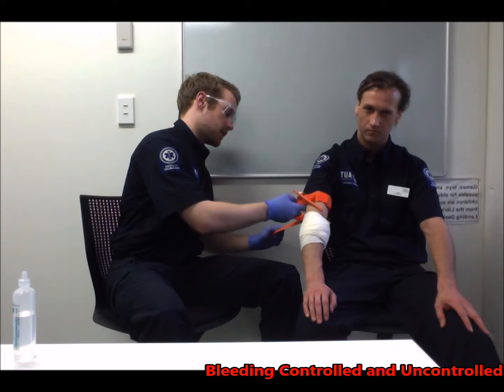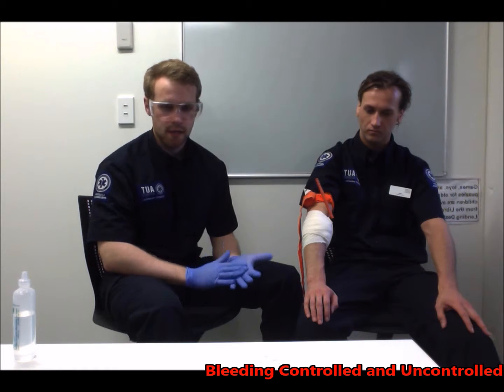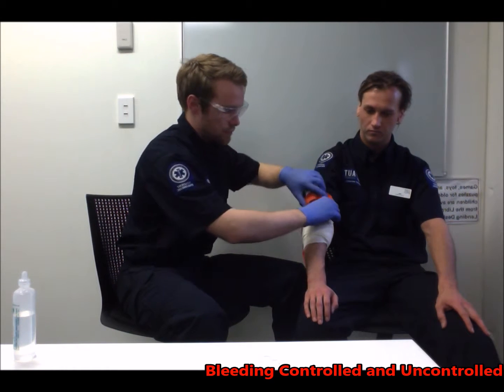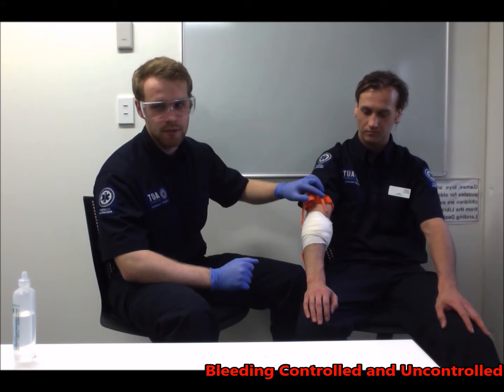You want these quite tight. You're going to put them on as tight as they can go. So with these, you want to crank these until the bleeding stops or till the distal pulse disappears. These are quite painful, so analgesia will need to be used.